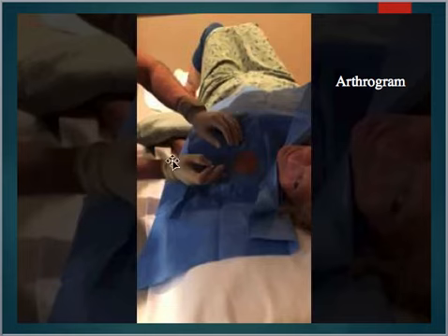iodine cleaning area, or actually it's called ChloroPrep now. Actually, it's an alcohol-based sterilizing agent. So they're going to clean off the entire skin, and then they lay this blue drape over it. This is all completely sterile. The radiologist has sterile gloves on, and they're going to inject a spinal needle, which is just a long needle, right into the joint space.